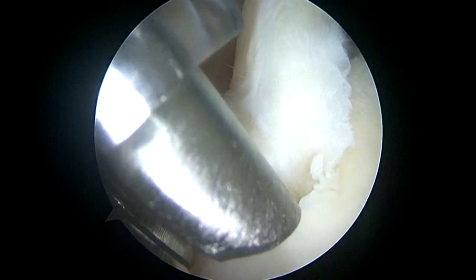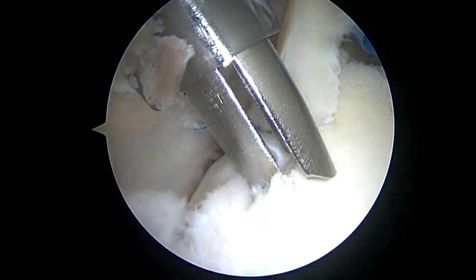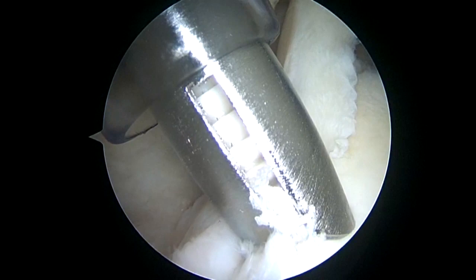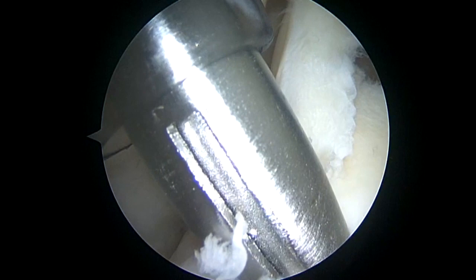I will place a second anchor more posterior than the first one. Here's the drill guide again. The drill has a hard stop. Then I'll insert the second peak anchor until the black line is buried.